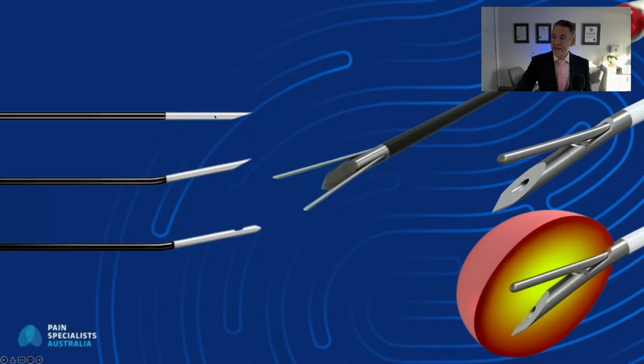So have a look there. That needle is straight, it's got a sharp tip. That needle is bent, it's got a sharp tip. That needle is bent, it's got a blunt tip. These different needles have different properties, and these different properties allow us to provide different treatments or different radiofrequency treatments. In the middle, you can see these tiny little prongs that have popped out of the needle.